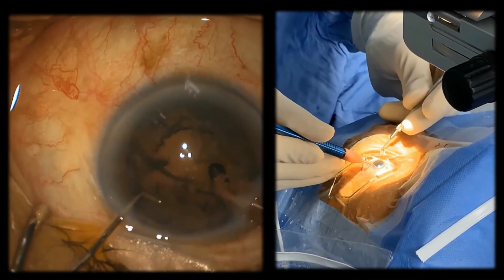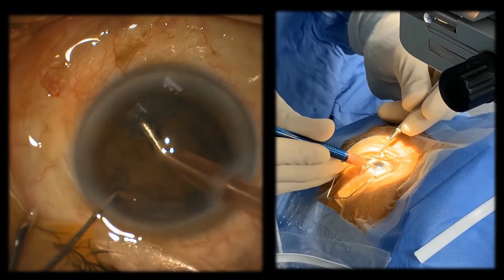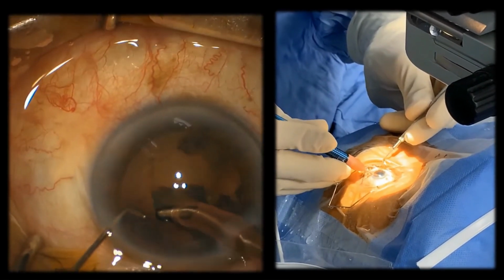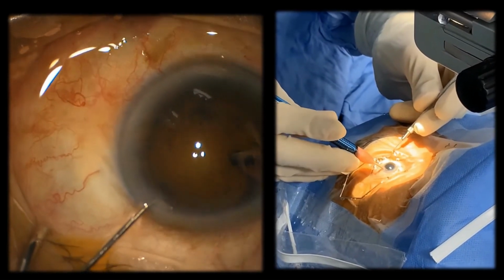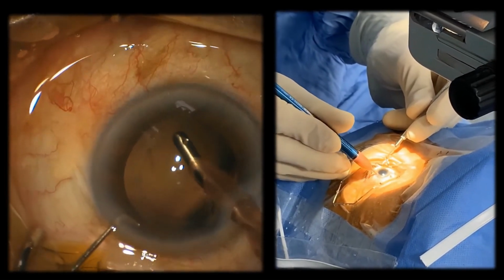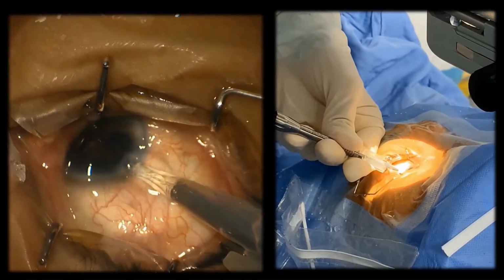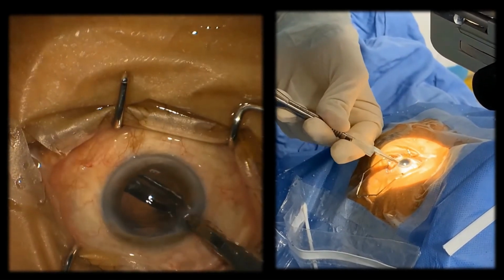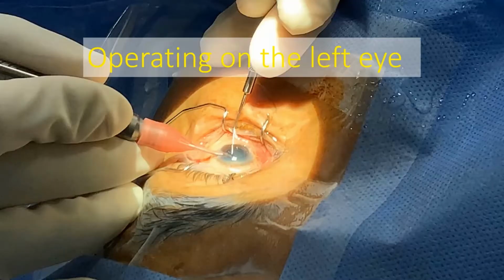Again, during the IA stage, the hand holding the IA is carefully placed on the lateral corner of the eye, and the maneuver is done using the pivoting action of the wound. The lens is inserted using a docking method through a 2.2 millimeter incision. What about the left eye?